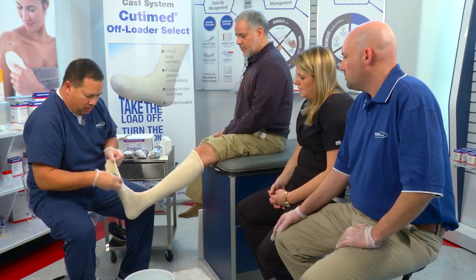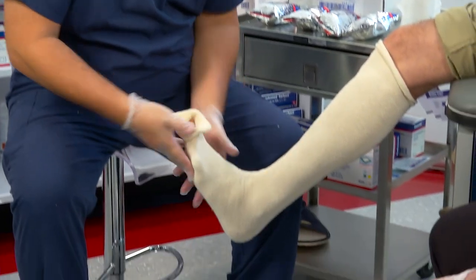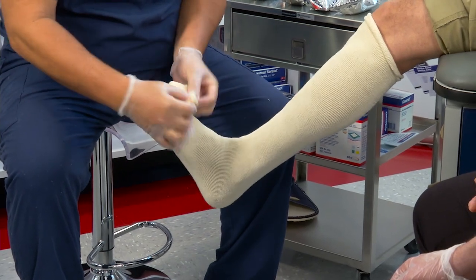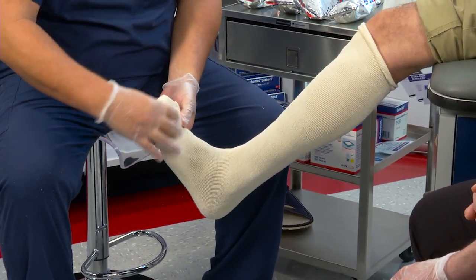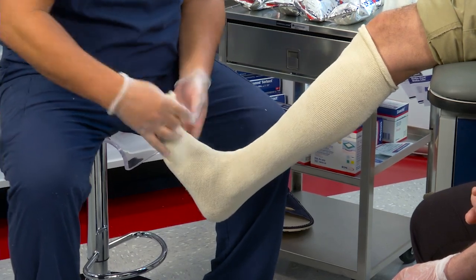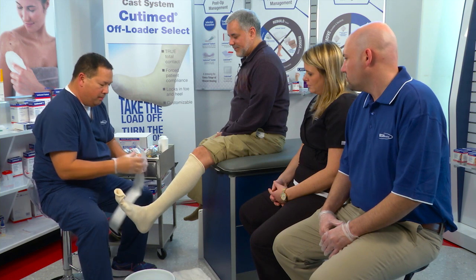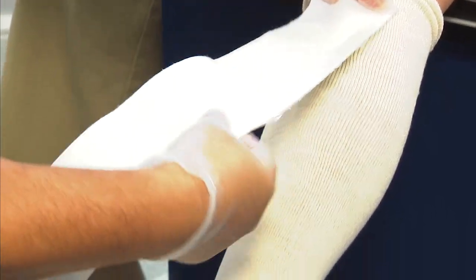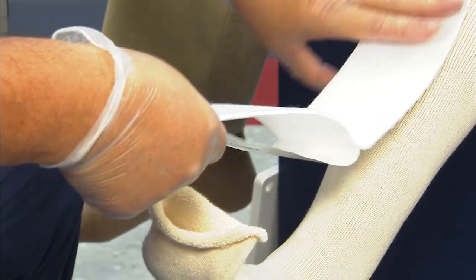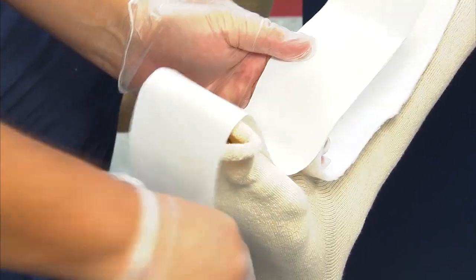Now that my dressing's in place, I like to fold this back over here. Make sure he maintains 90 degrees. I want to make sure this flap, this little fold, just falls over — I don't want to pull it and hyperextend his toes. I take this self-adhesive felt foam pad, attach it to my landmark which is the tibial crest, and apply this right down the spine as I'm applying it.